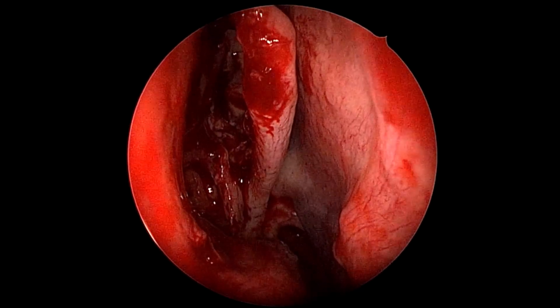When you don't traumatize the middle turbinate and everything, you hardly get any synechiae or scarring and crusting.